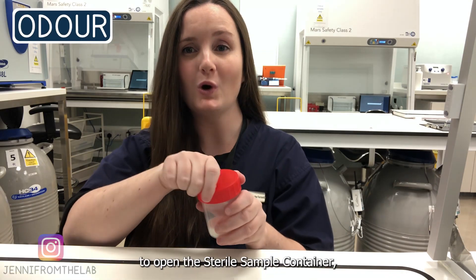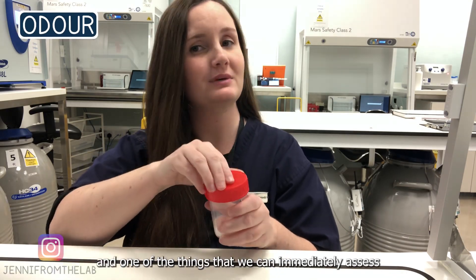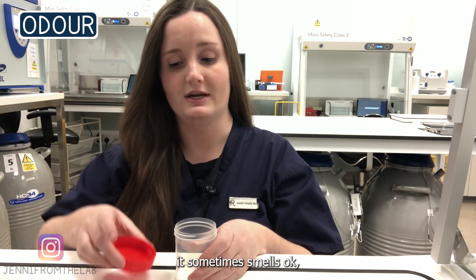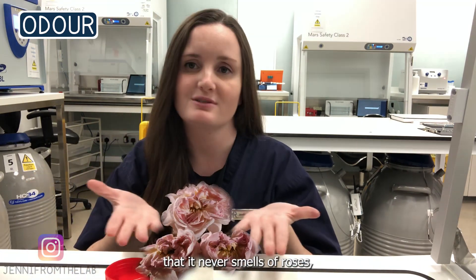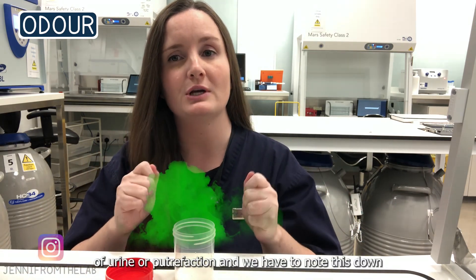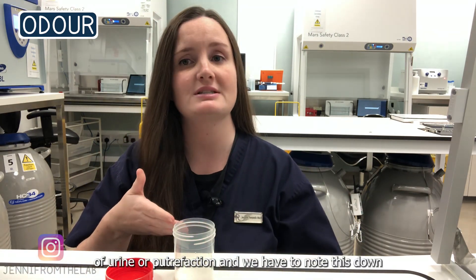We're going to proceed to open the sterile sample container. One of the things we can immediately assess is its odor. It sometimes smells okay, but I have to admit it never smells of roses. Sometimes it has a strong odor of urine or putrefaction, and we have to note this down as it can be of clinical importance.